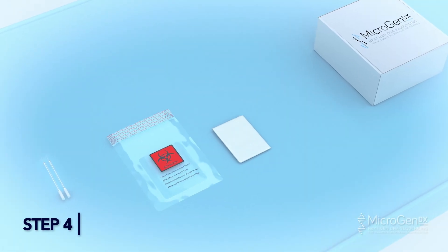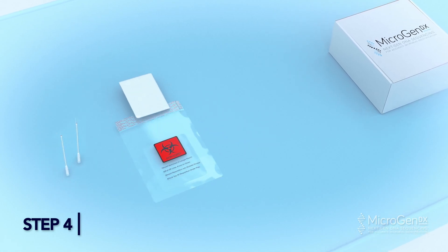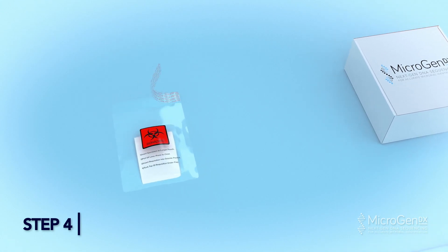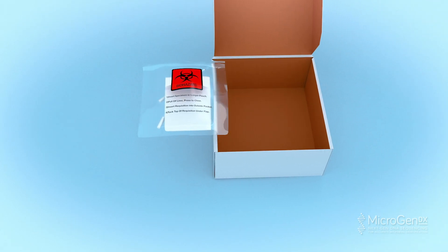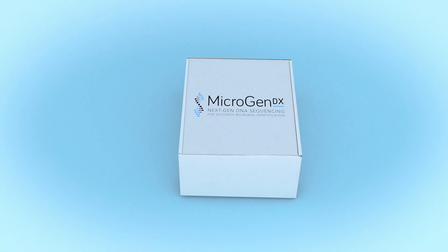Step 4: Place your completed MicrogenDX lab requisition form in the front pocket of the bio bag. Add both swabs into the larger pocket, peel off the adhesive strip, and press to seal the bag. Place the sealed bio bag into the MicrogenDX prepaid shipping box and send out according to your facility protocol. Alternatively, take to the nearest FedEx Dropbox.